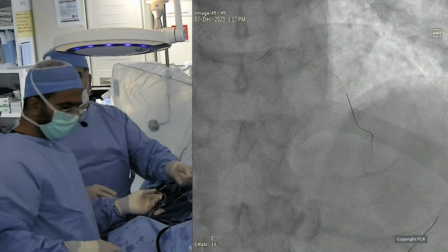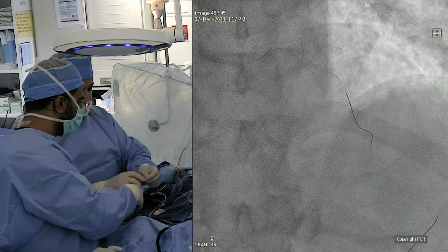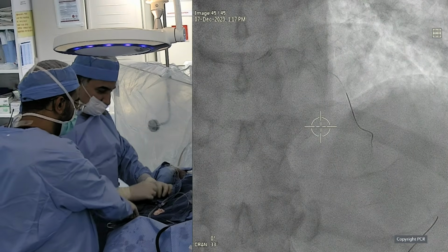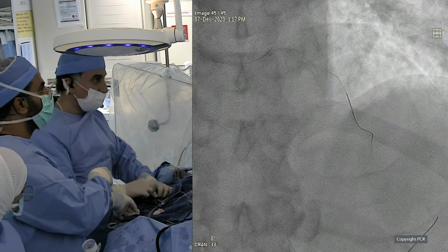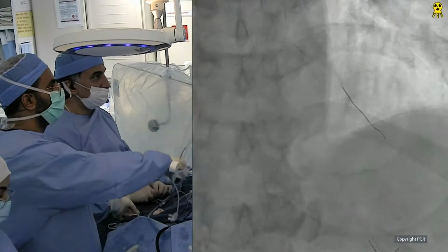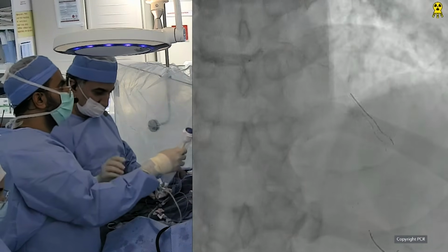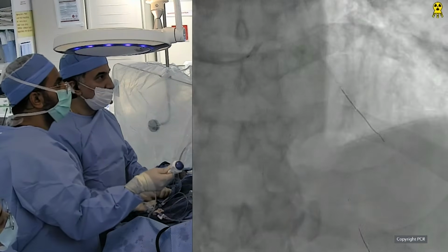I don't know how you do it, but usually what we do is we take the longest stent that we have for the distal part, appropriate to the distal size. We implant that, and then we see what length is left, rather than have 2 stents open according to OCT. I'm still not too confident about that. I don't know what you're doing, Julia. You probably plan everything. Well, that is the reason why we are using OCT, just to get the right measurements done. So it is something that is very relevant for selecting the proper stent.